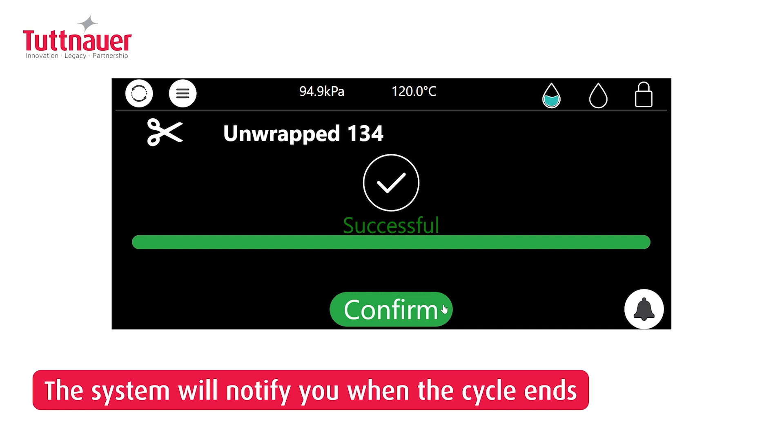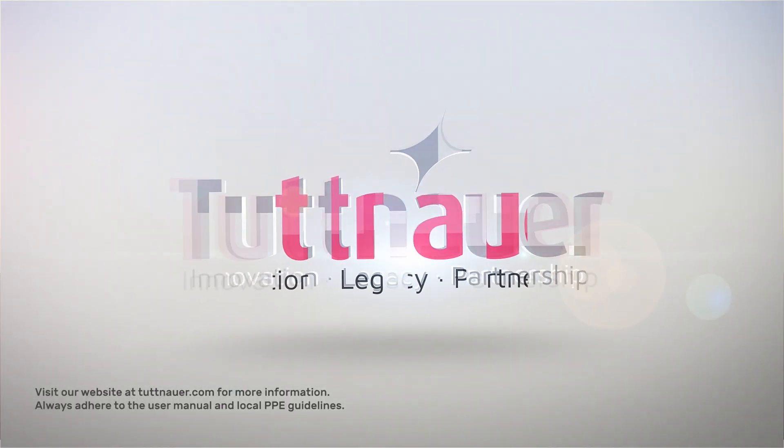At cycle end, the system will beep and display the outcome. Press confirm to unlock the door.